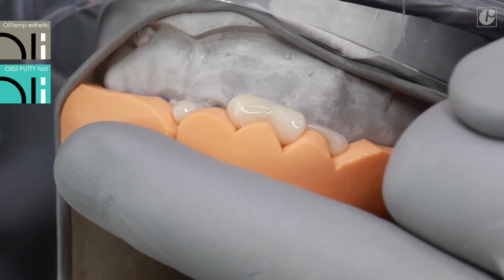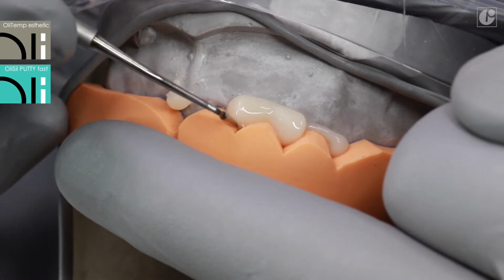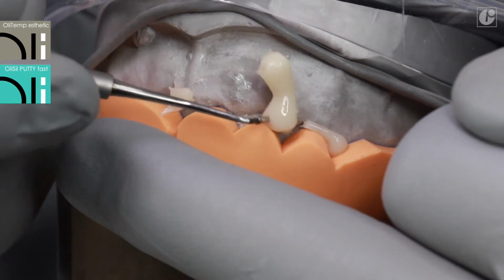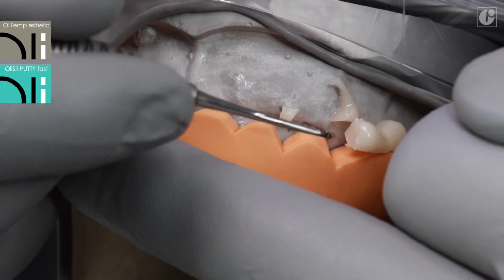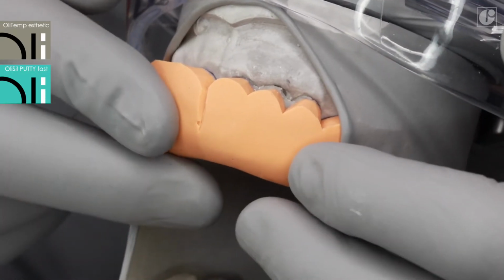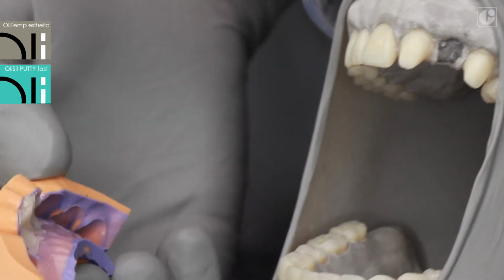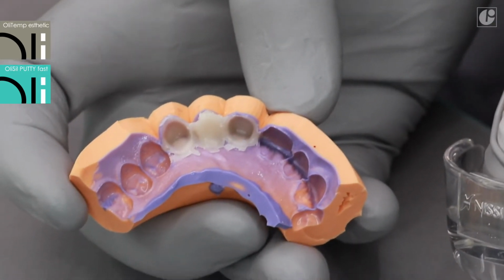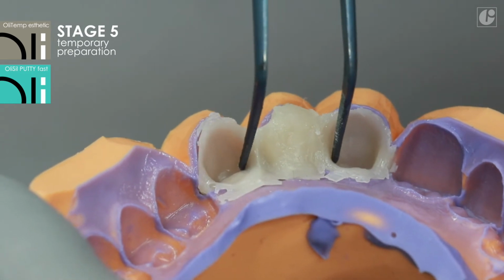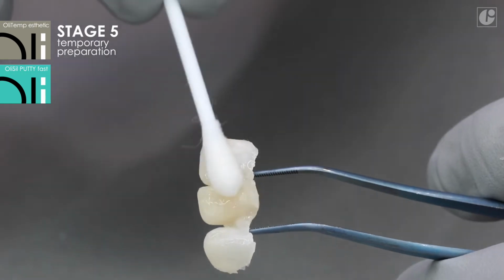Excess material allows for control of the OliTemp Aesthetic polymerization level. The impression must be removed during the elastic phase. An oxygen inhibition layer can appear on the restoration immediately after the impression was taken out. It is best to remove it with a cotton swab soaked in ethanol.